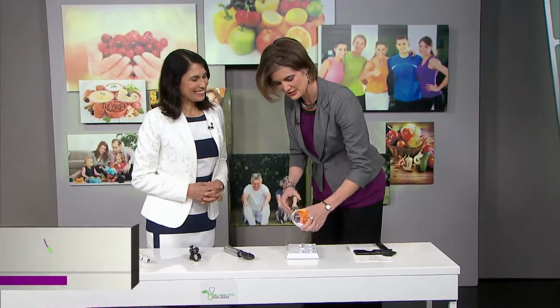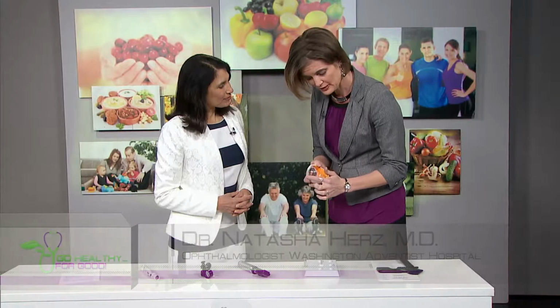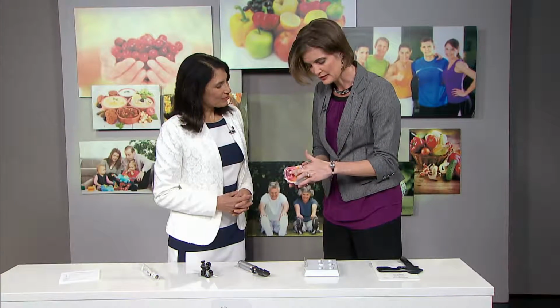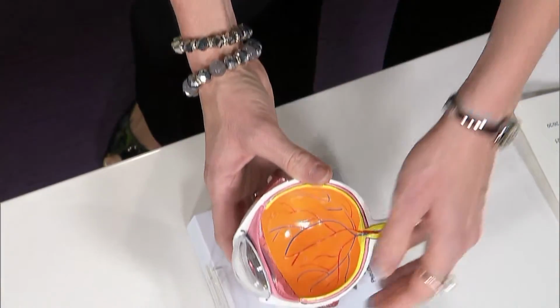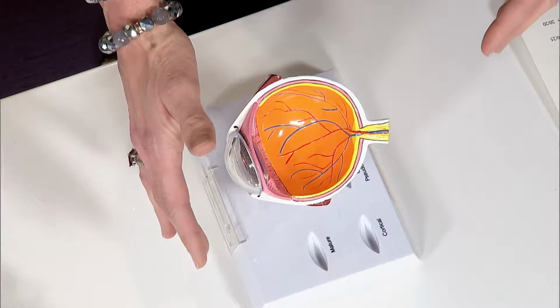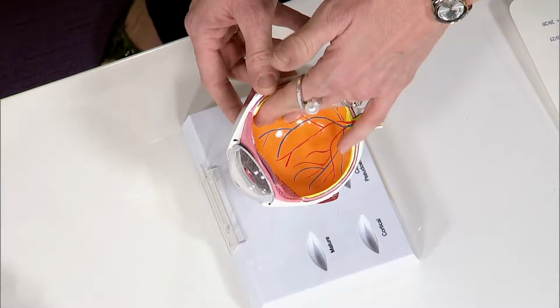Well, to make it so that everybody can understand what we're doing, I think it's helpful to go over the anatomy of the eye. The very front part of the eye being the cornea, and then the colored part of the eye is the iris with the pupil in the center, and then the lens being behind that. And so when I'm examining the eye, I examine those things with a high-powered microscope called a slit lamp. And then I also look inside the eye at the optic nerve and the retina and the blood vessels to check for any kind of eye disease.